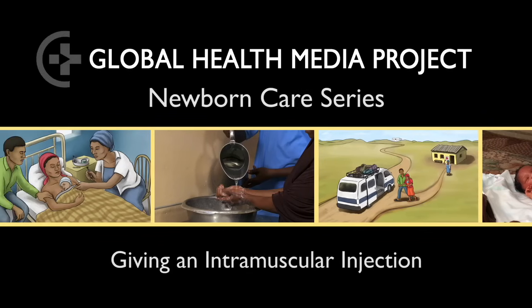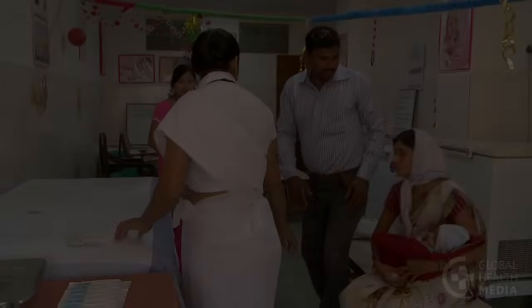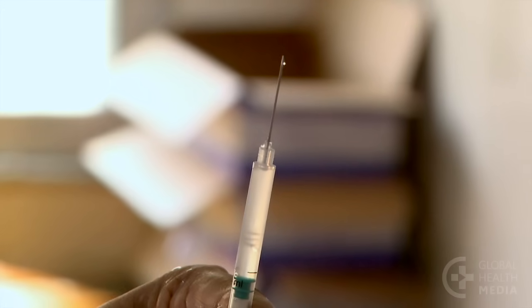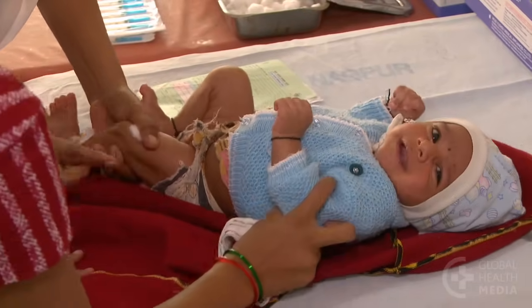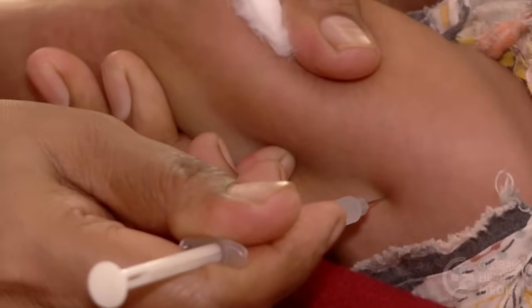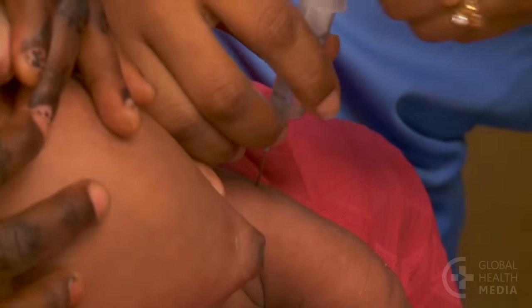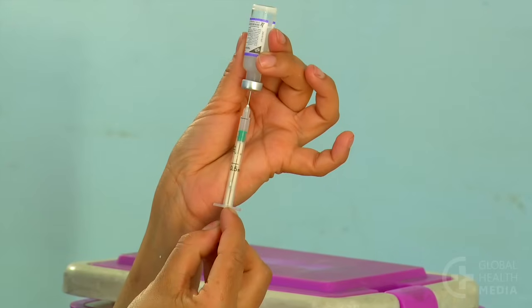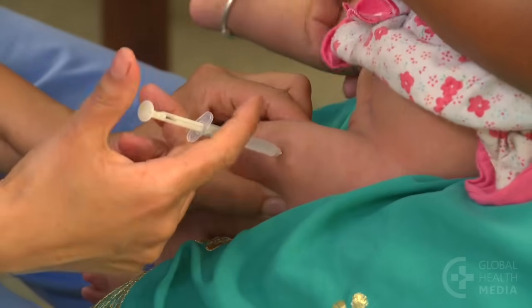Giving an intramuscular injection. An intramuscular or IM injection delivers medicine directly into a muscle. Treatment levels are reached quickly, making it an effective route to give medicines to very sick babies. This video will show how to safely draw up and give an intramuscular injection.